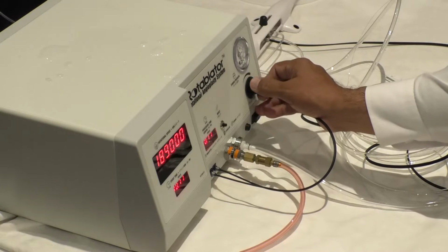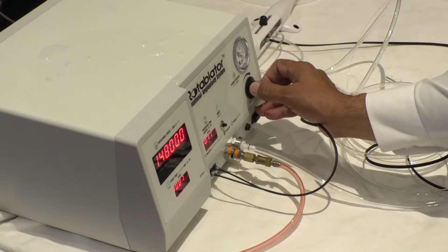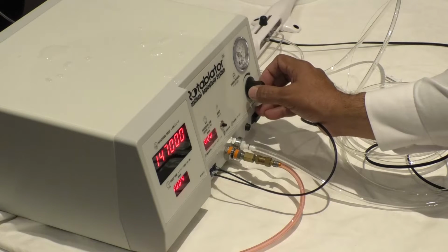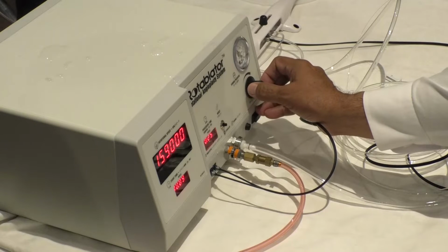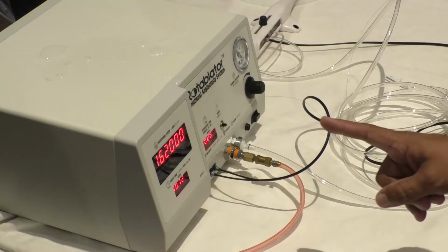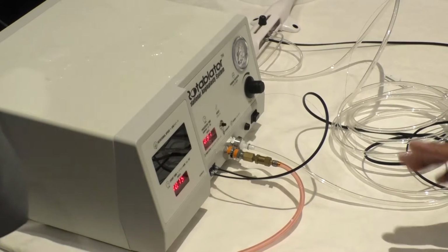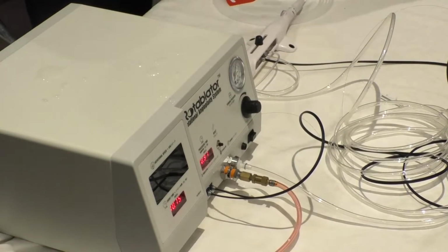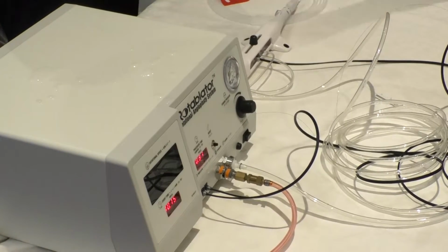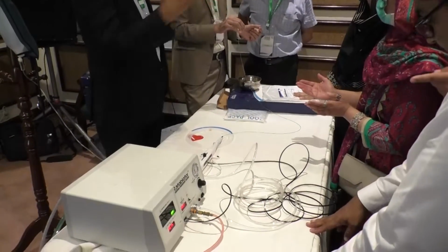It should be there. अगर आपने outside body चेक किया और इतना सा fluid नहीं है, it means it's not coming out. Check your this pressure, this, and this. It should be like this. Dynaglide can be 60-70. Okay. So 160 and we have said 150. Yes, it's for 60 to 80, then 140 to 160 on the side.